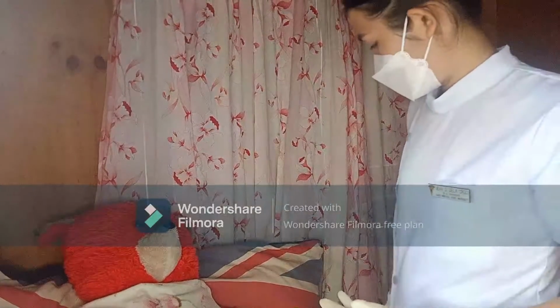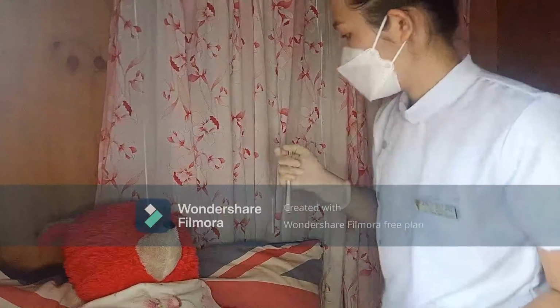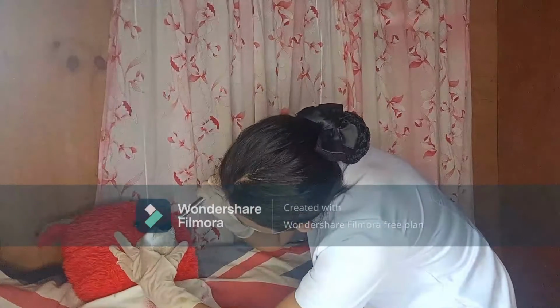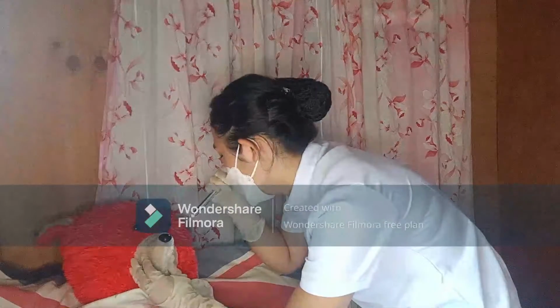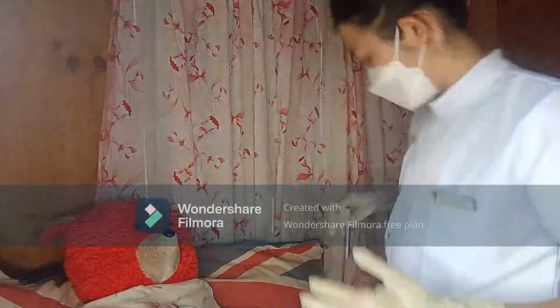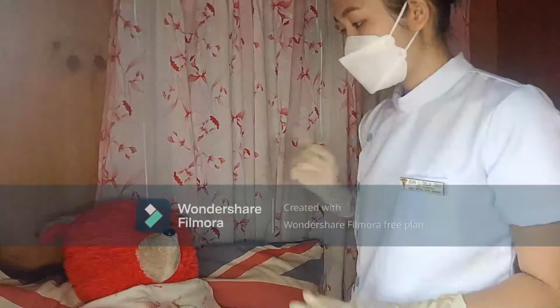Ask the client to hyperextend the head and using a flashlight, observe the intactness of tissues of the nostrils including any irritations or abrasions. Examine the nares for any obstruction or deformities by asking the client to breathe through one nostril while occluding the other.